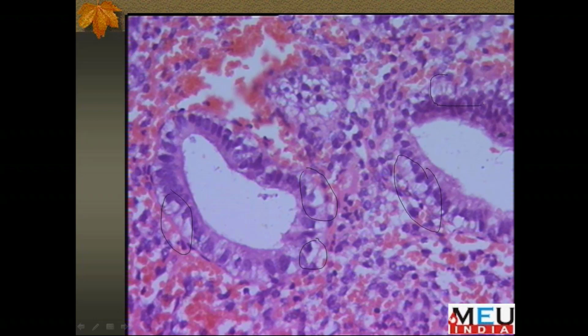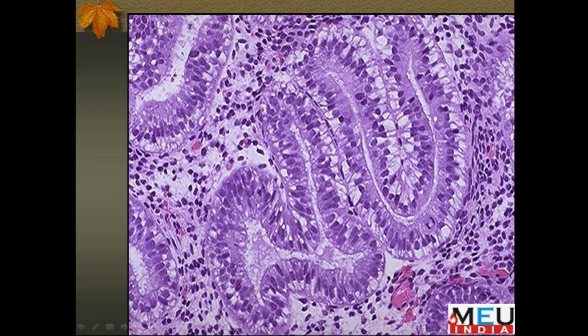endometrial gland. Basically, they provide nutrition to the ovum, which the endometrium assumes has come and eventually will be fertilized. So the secretions in the lumen of the glands start appearing, and the vacuoles start disappearing, because basically they have shed themselves inside and we find a lot of secretions inside the glands.